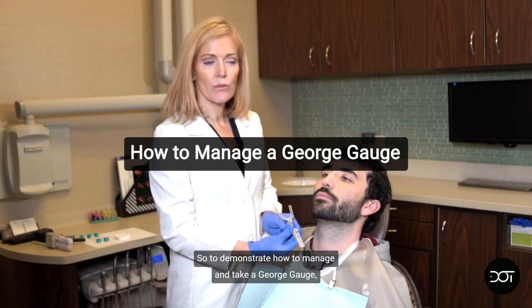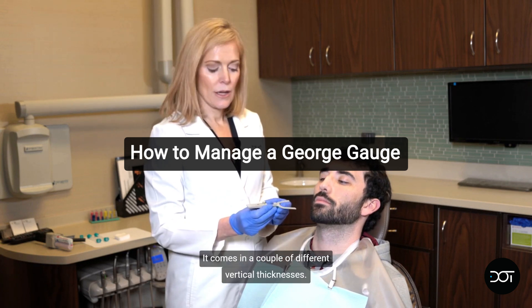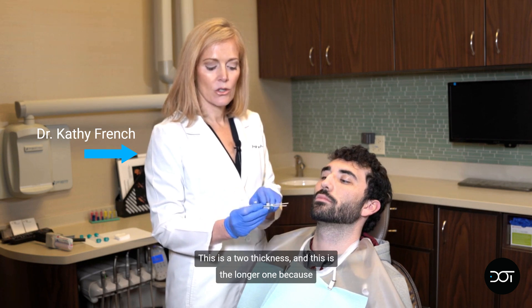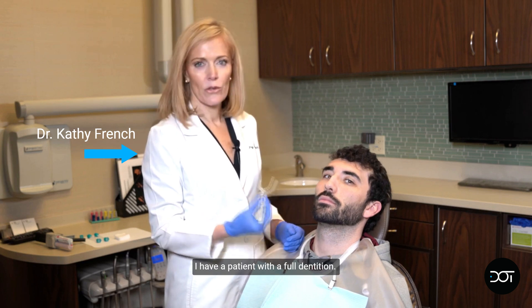To demonstrate how to manage and take a George gauge, this is what it looks like. It comes in a couple of different vertical thicknesses. This is a two thickness and this is the longer one because I have a patient with a full dentition.